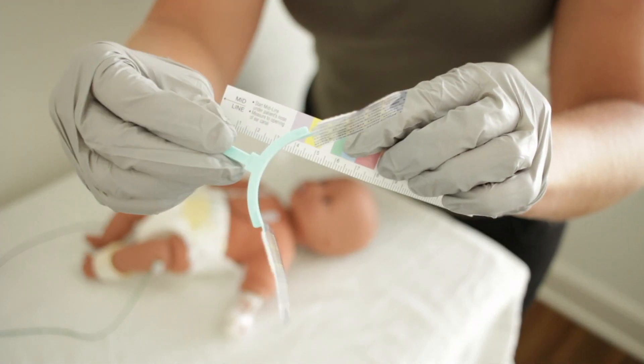Once you've selected the appropriate size neobar, do a quick trial run on your patient with the neobar to make sure it's an appropriate size on the patient's face. After you've done your test fit, you'll then need to prep your patient's skin. This is especially important if you are placing a neobar on a patient in a resuscitation after delivery, as there's a lot of moisture on the skin that you'll need to remove to ensure appropriate adhesion of the neobar.